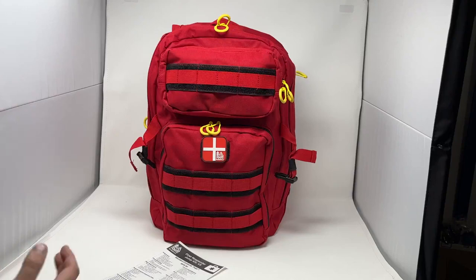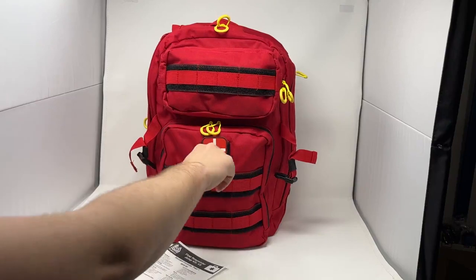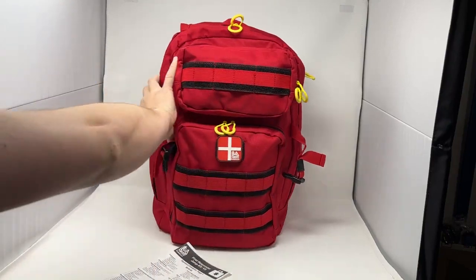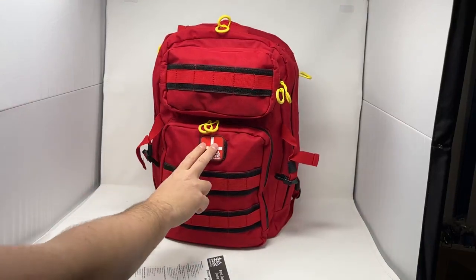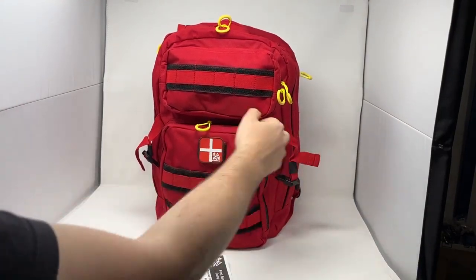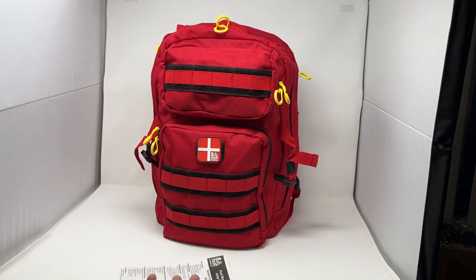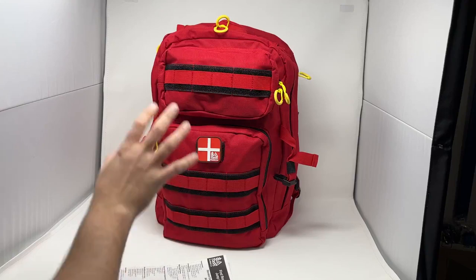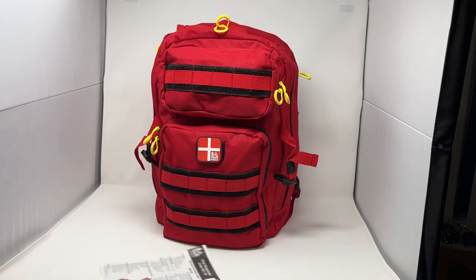We chose a really high-vis red bag. It has lots of MOLLE and webbing attachments on the front as well as both sides, so you can fix other gear to this. There's a high-vis medical patch, and we chose these really oversized, easy-to-grab zippers. These zipper pulls can be grabbed even with gloves on in colder weather. The bag itself is pretty phenomenal, and then we'll go through the contents of the kit.